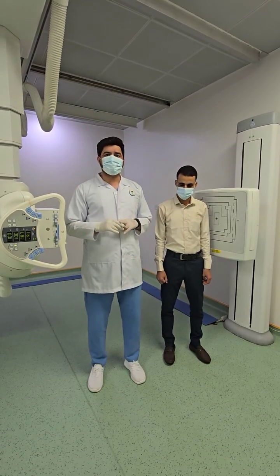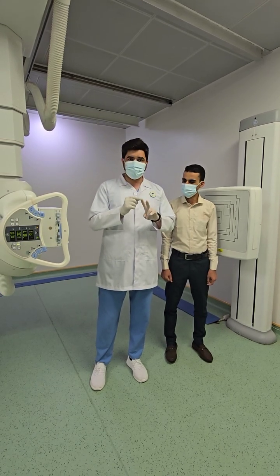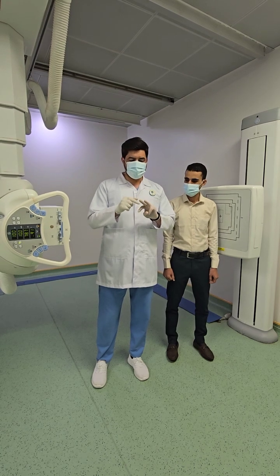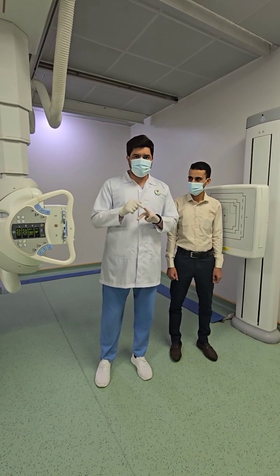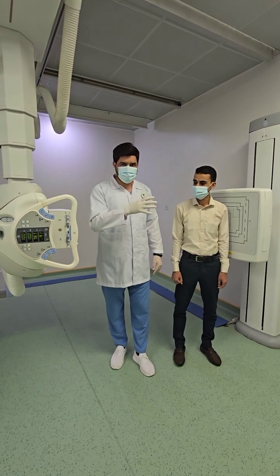Okay. In the standing, or erect, we have three further positions. One is PA, posterior anterior, another is AP, anterior posterior, and the third one is lateral. We will start from the PA. Okay, this is the X-ray tube. From here the X-ray will come out.